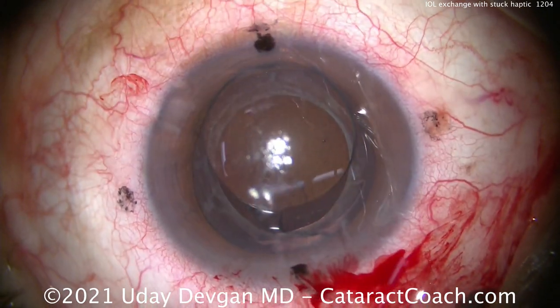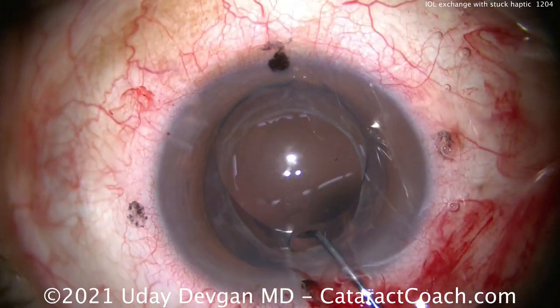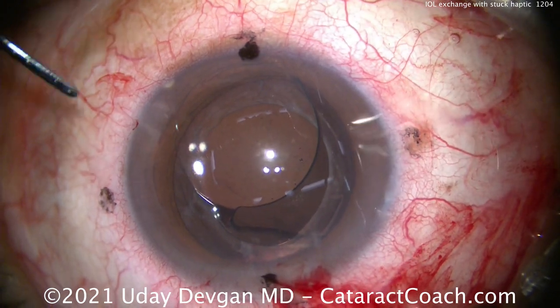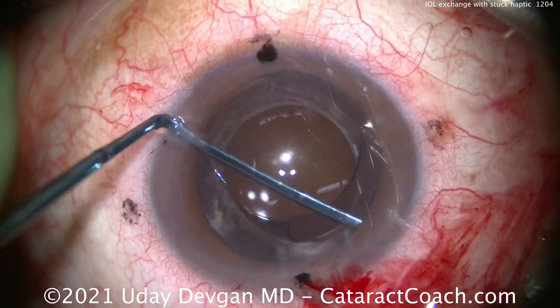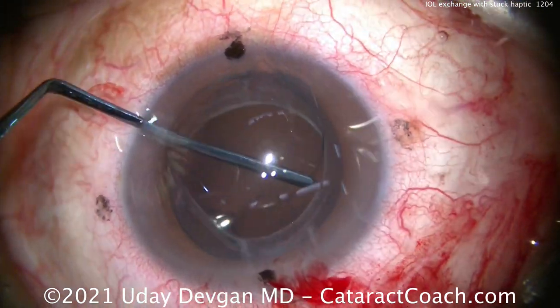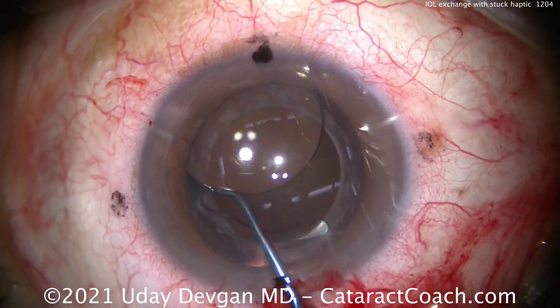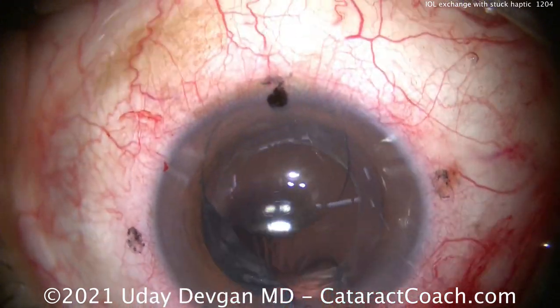Being very delicate here — you don't want to damage the capsule. This capsule is wimpy. Still not enough. I just want to keep trying and do as little as possible. I don't want to damage the capsule. So I'll do it again. And I think that may have done it. Let's see. I felt like that may have done it. There it is — we freed it up.